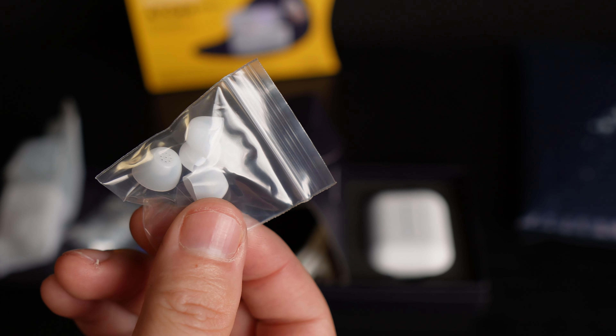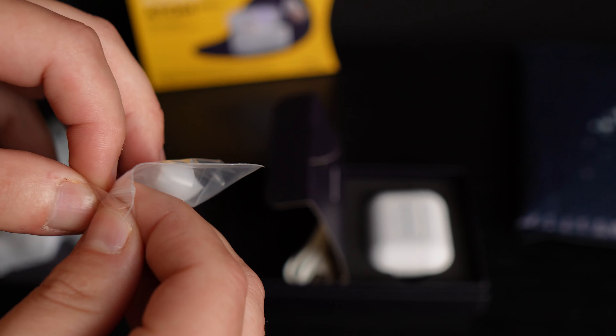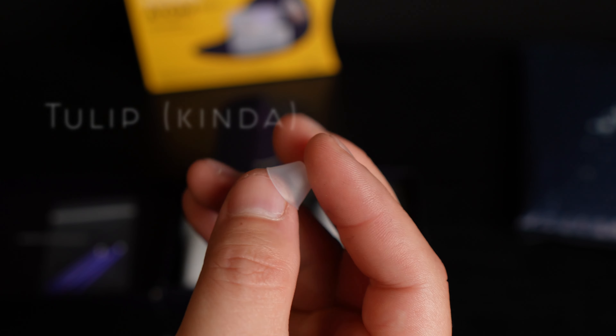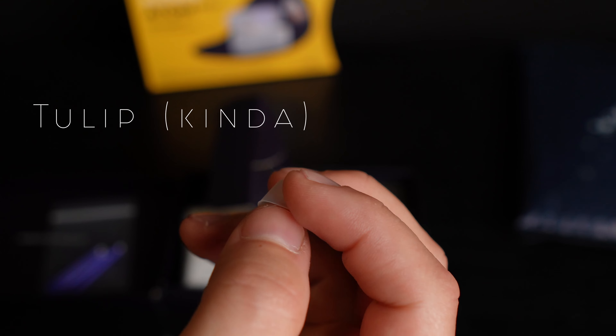The Atom 2 and Atom Pro 2 both come with two different types of domes, and each type has three different sizes: small, medium, and large. The first type is a cup-shaped dome and the other style is more of a tulip-type dome. I'm going to show you a tip on how to actually turn these into a tulip if you want to try it yourself.